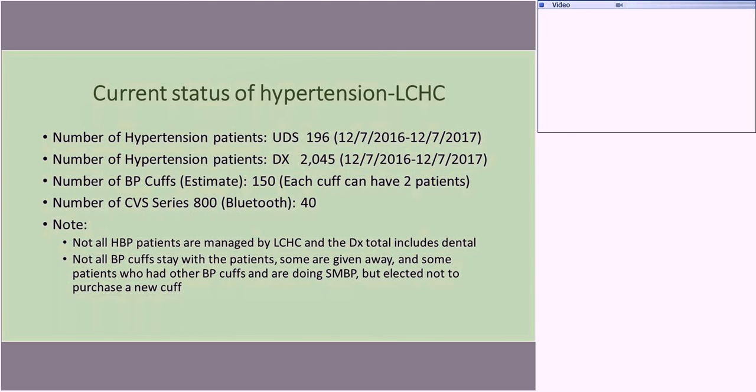I would mention that the initial year, while we had very good success of having patients bring the blood pressure cuff in and being able to upload the data, one of the disadvantages of having patients very knowledgeable is they also forget their cuff in the car, and they would often come in and report that their blood pressures were doing very well at home, but we would not get any official uploads because they didn't bring the box in. And the Bluetooth looks like it's getting a much better level of capture of data as we implement this. And the ease of sending the information in allows us to make a phone call to get somebody to upload if they've missed appointments or have had a change of medication and have forgotten to do the uploads. That is promising technology we're currently using.